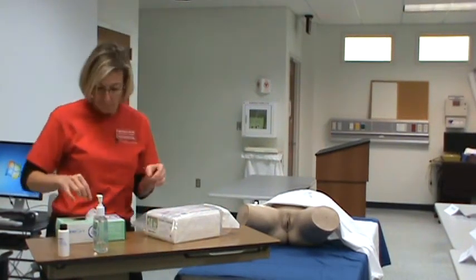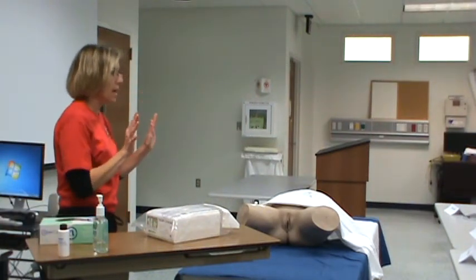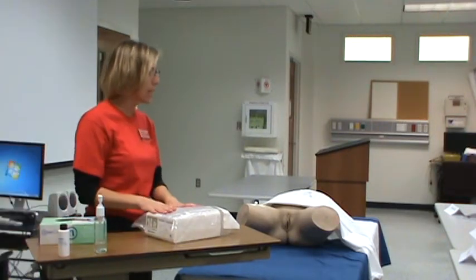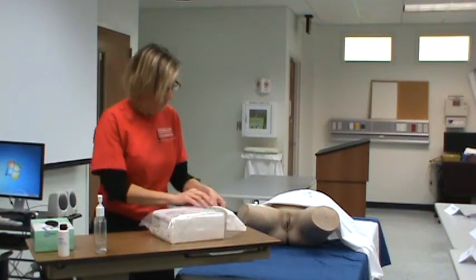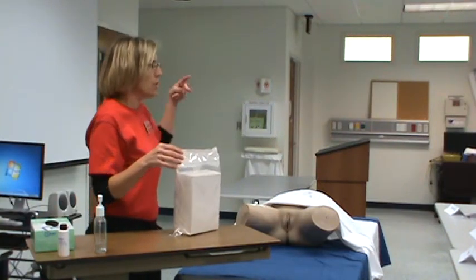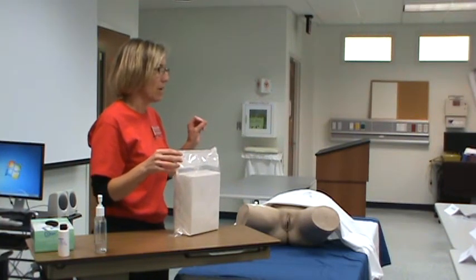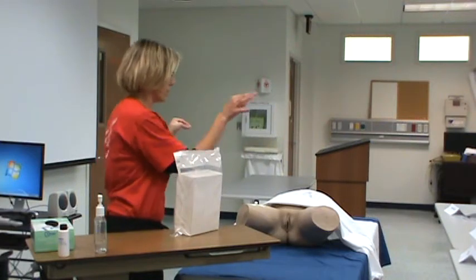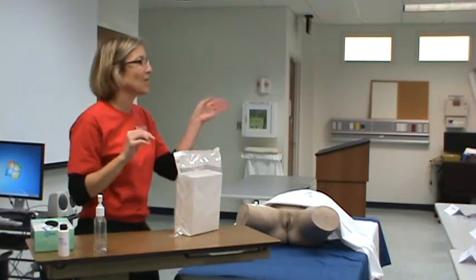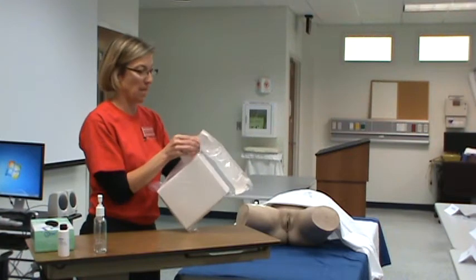All right. Okay, so as I'm draping her that way, like I said, I'd have my gloves on. I'd switch out my gloves, do a little hand hygiene, and get ready to set my kit up, okay? So the kits, all of them are different. Even in the video that we showed you, one of the kits had the underbutt drape right away as the first thing. Well, if it's the first thing in your kit, you take it with your bare hands, only by the corners, and you put it under. Most of our kits will have the gloves on top, and you'll see that's the way I'll demonstrate. I'm not exactly sure if this one has that, but I'm pretty sure.